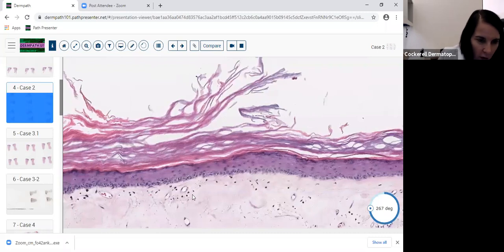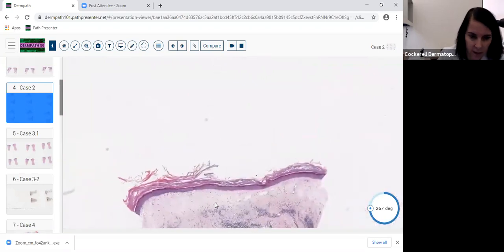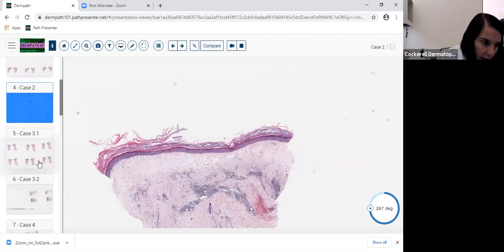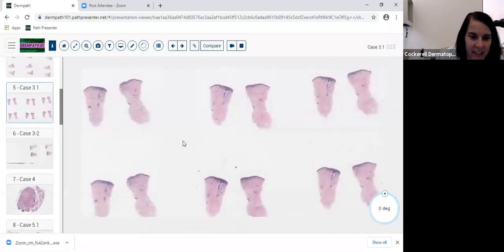If you start going off the rails and saying, this is dysplastic, I think it's a pre... no. Look at your keratin layer and see there's no parakeratosis. That'll help you back off of AK or something crazy if you start going down that route where you say, well, maybe this is just an inflamed AK. Don't do that. Don't go off the rails. So, lichen sclerosus et atrophicus. I think I went over everything in the differential, really. Exhausted it. All right, next case is a gorgeous punch.